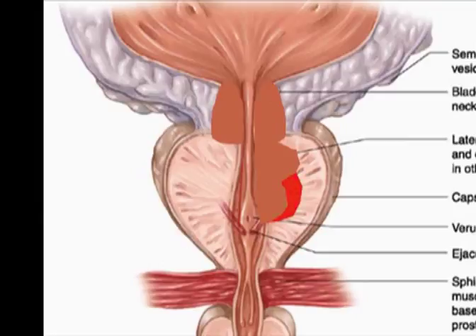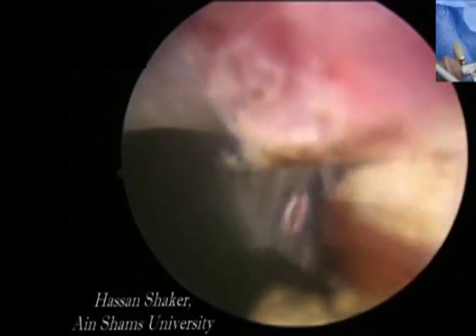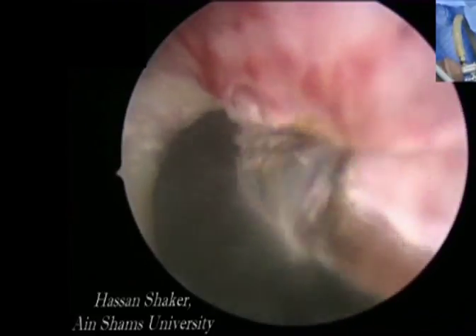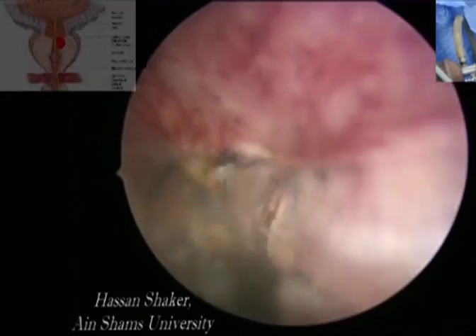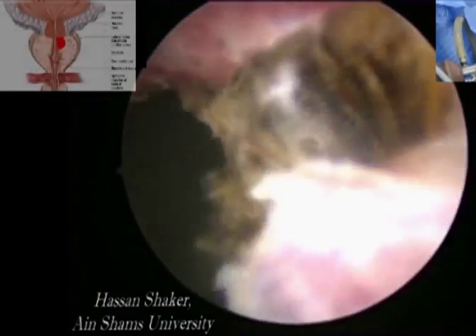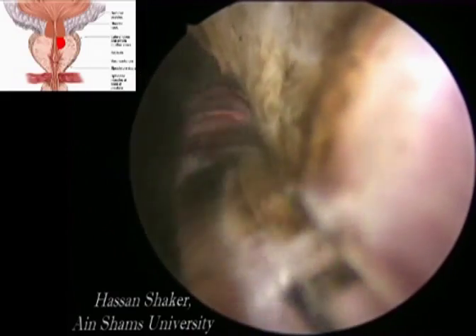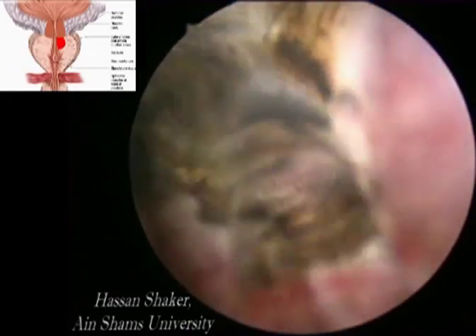One lobe is totally finished before moving on to the other one. We usually start at 12 o'clock, working our way to 6 o'clock. Anterior tissues are reached by rotating the scope. We start by ablating the proximal half and ablation is done in layers until the capsule is reached.